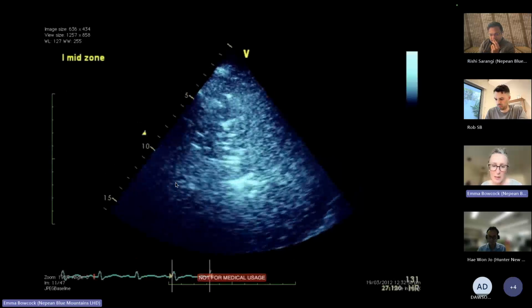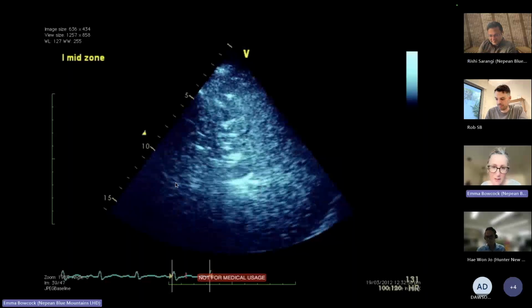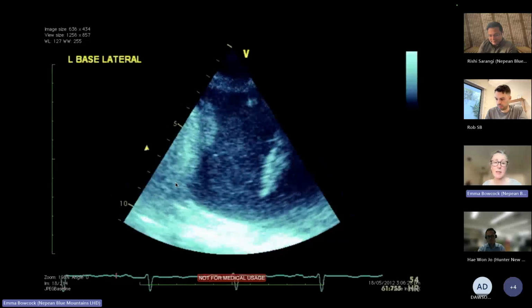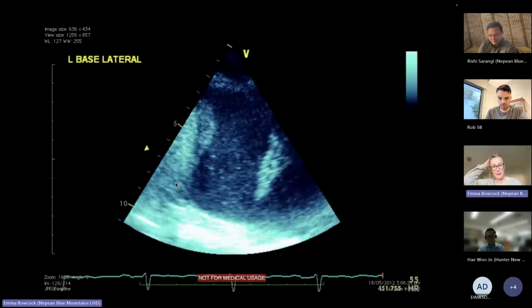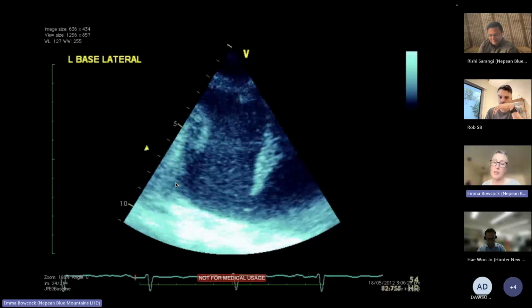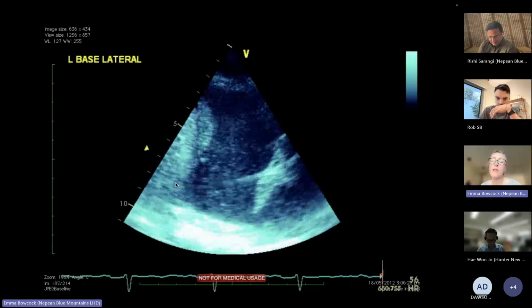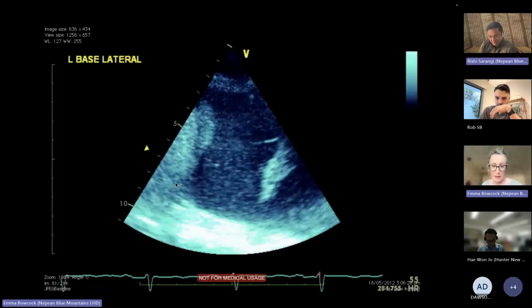Nice one. How cool is that? Those dynamic and static air bronchograms, hepatization of the lung. So probably a bit of consolidation, maybe a bit of collapse as well. And a nice, massive pleural effusion, collapsed lung, and all this sort of particulate matter in it, which could be exudative, absolutely. You can't see any septations, which I should have included some of, actually, of an empyema. I'll put them in maybe for next time.